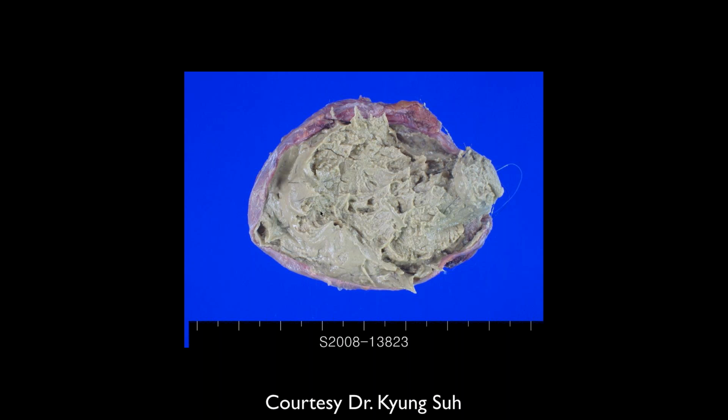Yeah, I was kind of going about dermoid, but I'm not quite sure. Yeah, so this is what a dermoid looks like, okay. In gross specimen, and this was a dermoid cyst. Kind of looked weird on the T2. It should be slightly bright on T2, right? Yeah, they vary a lot, but okay.